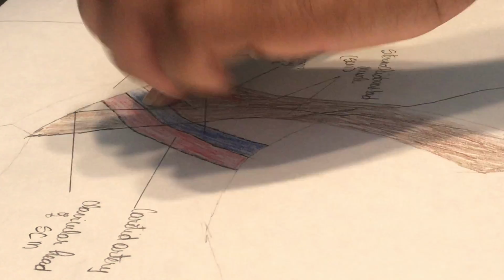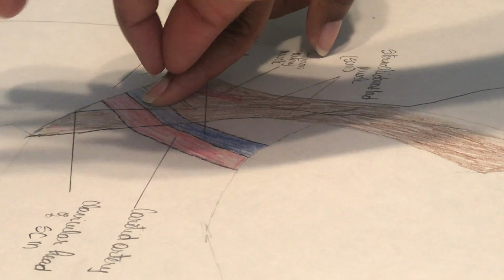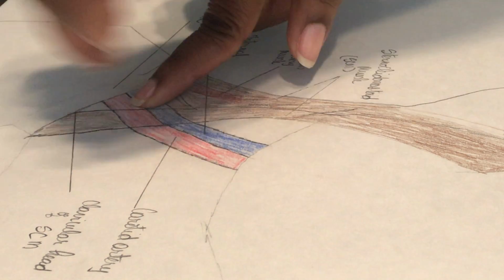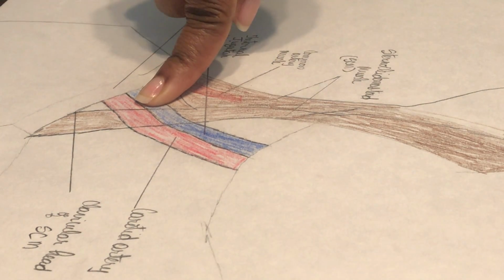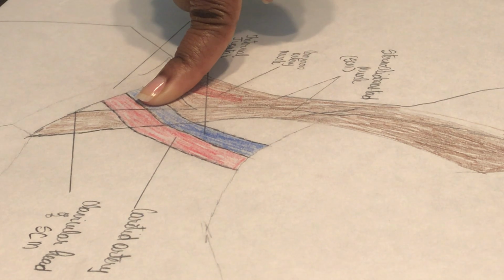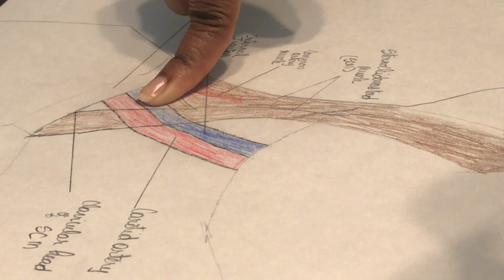Now I take my dilator, and I insert my dilator over the guide wire through the skin into the vessel in a twisting motion. Once that's in, I can remove my dilator again, and I take my catheter. It's a 3-lumen catheter. Before I started the procedure, I flushed all 3 lumens in the catheter to make sure that the lumens are patent, the catheter is patent, and also there's no air remaining in those lumens. And I clamp the other two lumens, and then I leave the brown one unclamped.